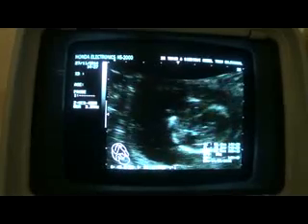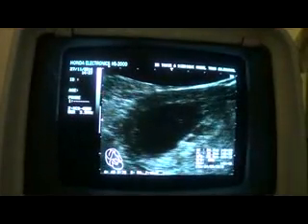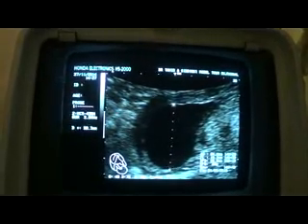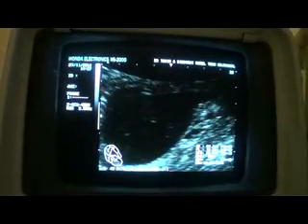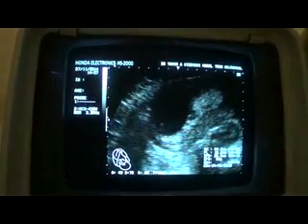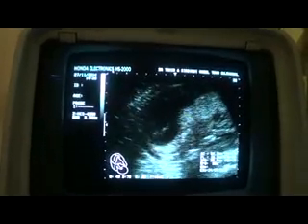The amniotic fluid is not... that does not fit into the category of polyhydramnios, as the single largest pocket of fluid measures approximately... this is not the accurate one. The fluid pocket should be evaluated without including fetal parts and umbilical cord, and then find the largest one.